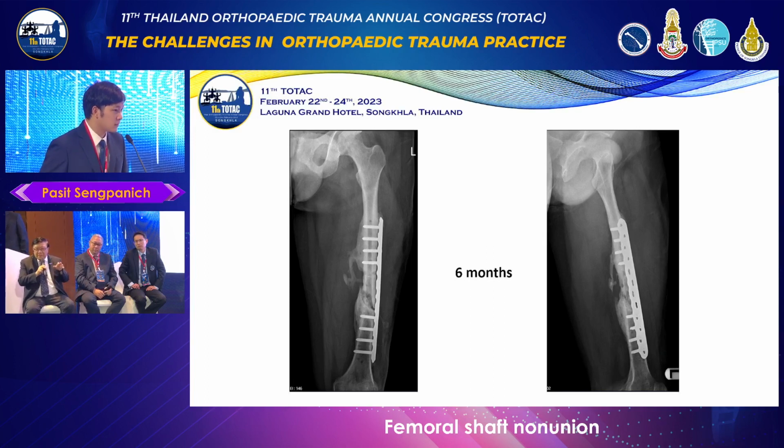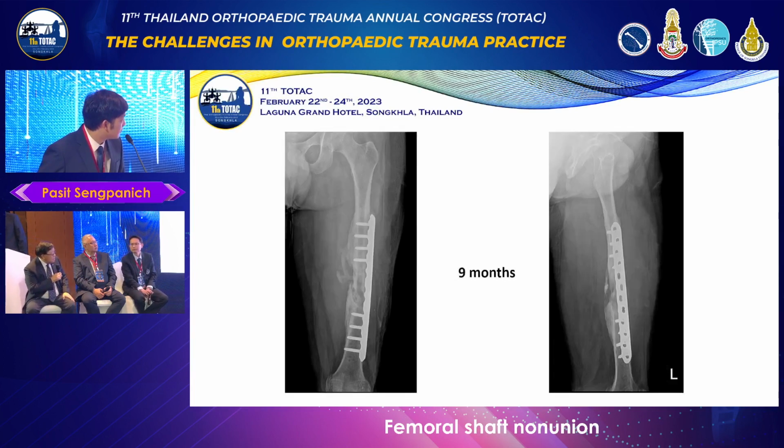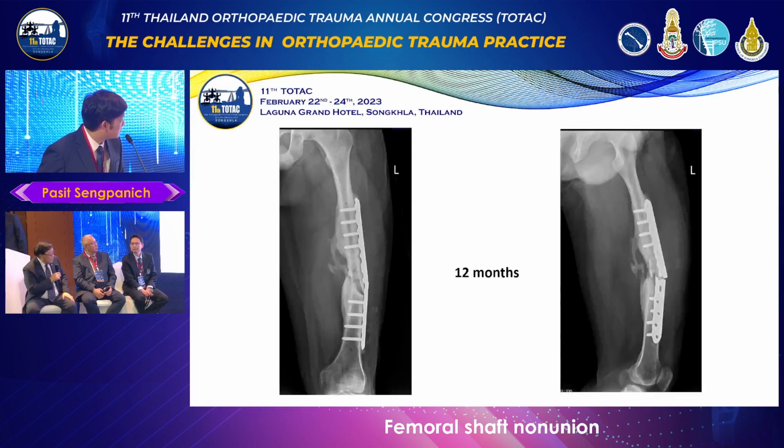It's always the question whether it's stability or biology. But in this case, I think there's both. The stability and biology are not good because it started with an open fracture, multiple surgeries, some dead bone. So probably you need more graft. Okay, now after 6 months, you see, next 9 months, and then 12 months. Yeah, that is what happened. Okay, what will you do now?